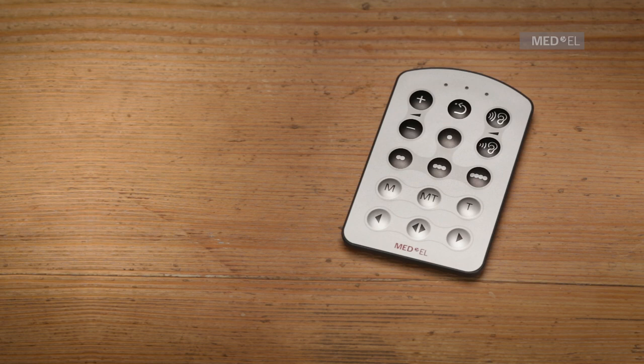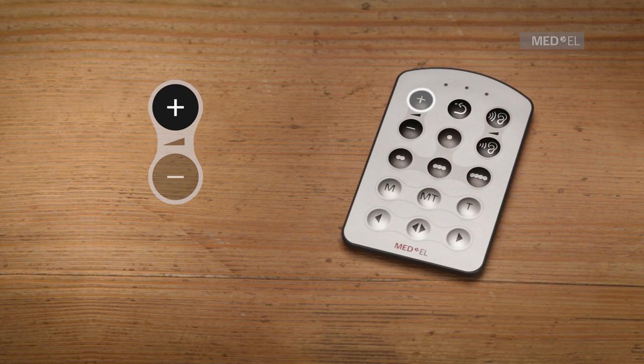To turn up the volume with the fine-tuner, press the volume plus key. To turn the volume down, press the volume minus key.